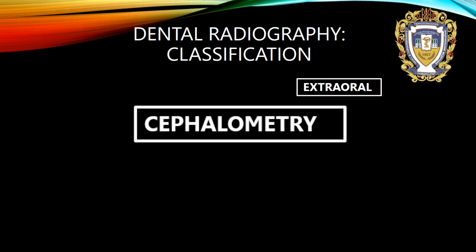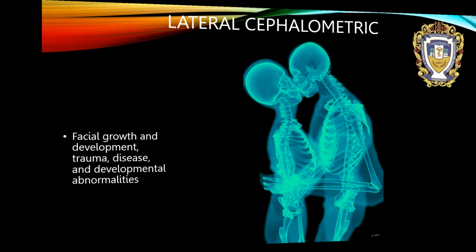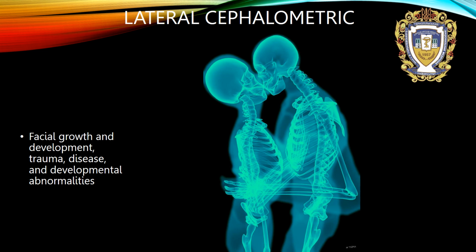Extraoral cephalometry. What information can we get from evaluation of cephalometric X-rays? Facial growth and development, trauma, disease and developmental abnormalities.